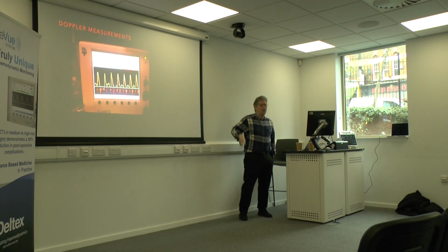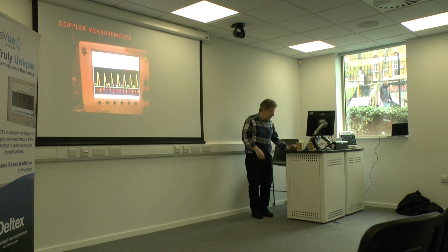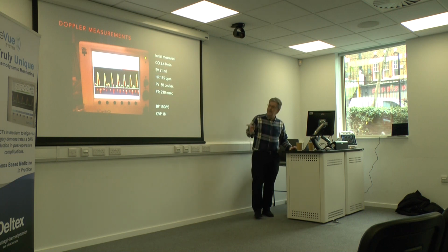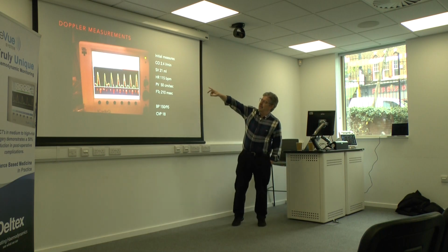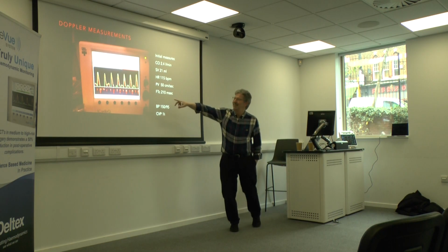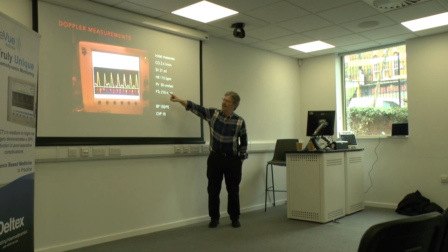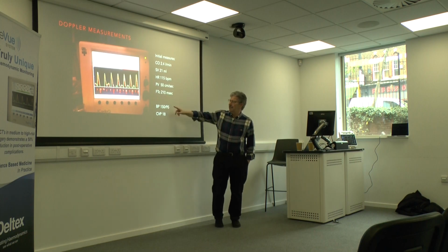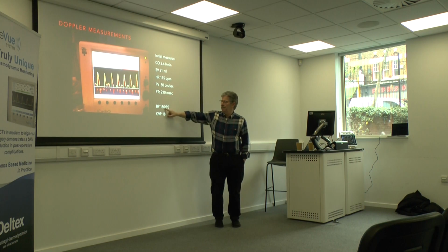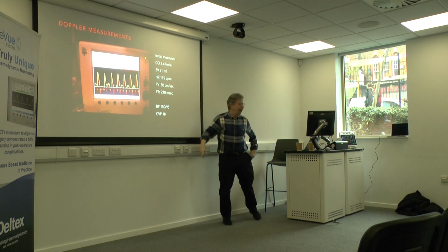Okay. So what now with that? What would you think? Then try some fluid challenge. Okay. So when we put the probe in, those were the initial measures, and that was after fluid. So it was 210 post-fluid, and we got it up to 230. So it still looked empty, didn't it? But the blood pressure and the CVP were even higher after.